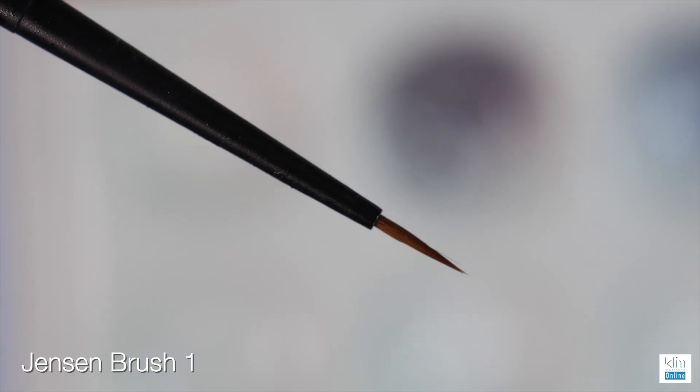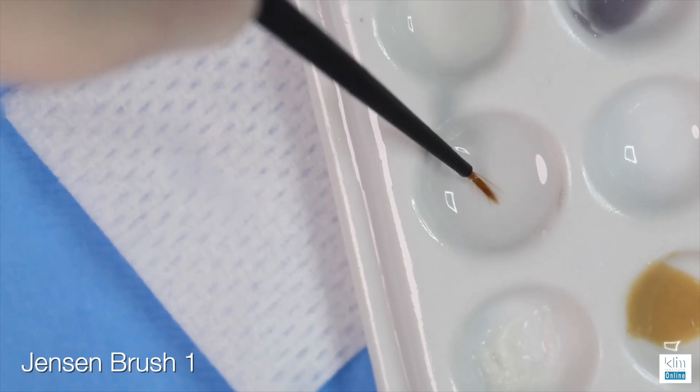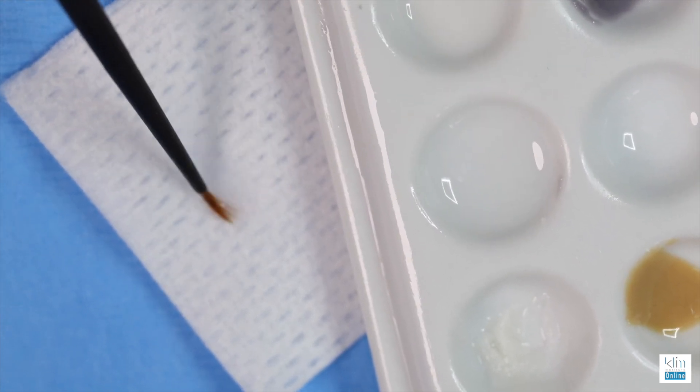What we're going to do next is add low value, so we're preparing that incisal edge. We want that glaze to be very thin on the incisal edge. With brush number one in the 850 MEO kit, we'll use that to add colors. The next step is to start adding low value on the incisal edge.